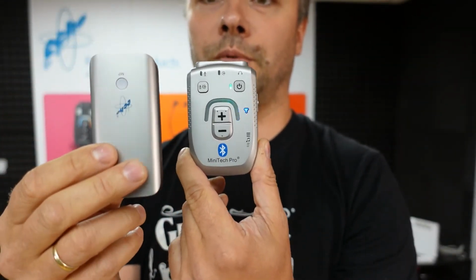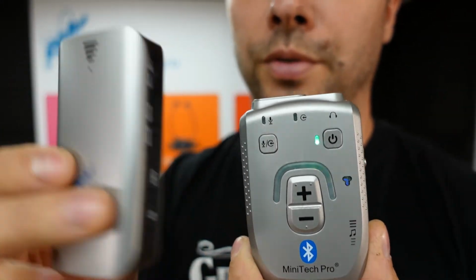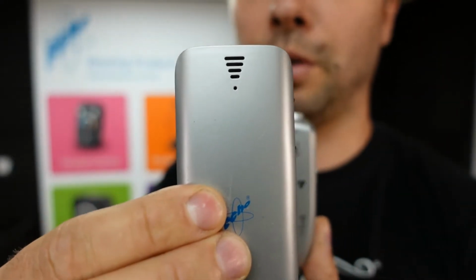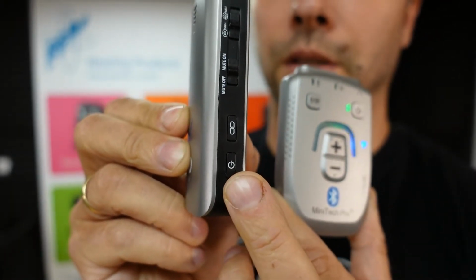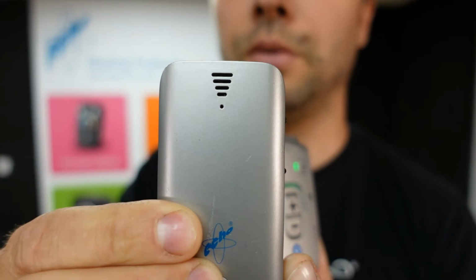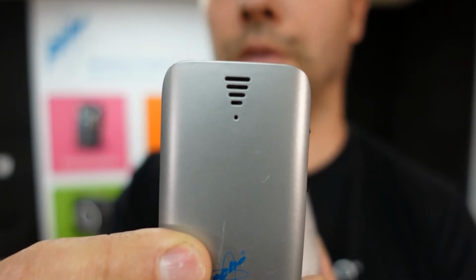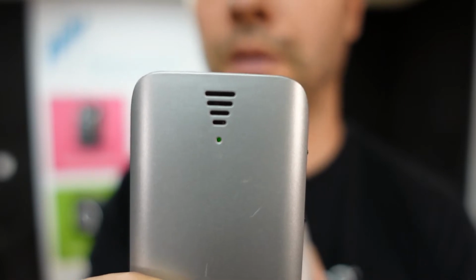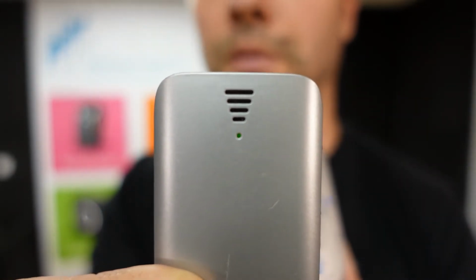And now it's time to clear the memory on our Bluetooth transmitter. From the off position, now the transmitter is off, you can't see any LEDs. Locate the power button, which is right here, and press and hold the power button for around 12 seconds as well, until you see the orange LED. So it's green now. And now it's orange, which means the memory is cleared.